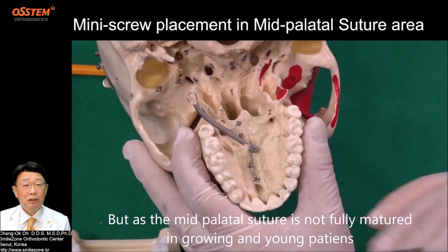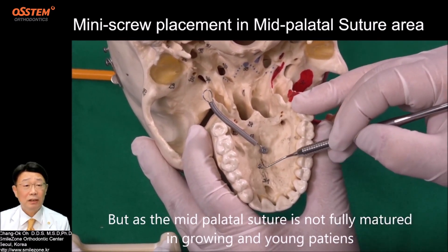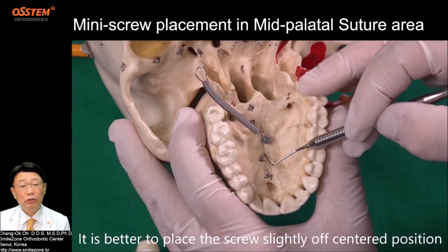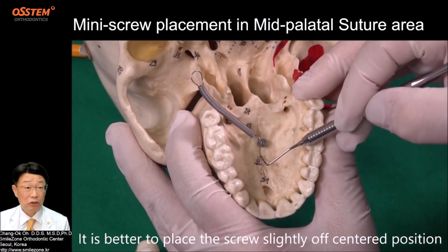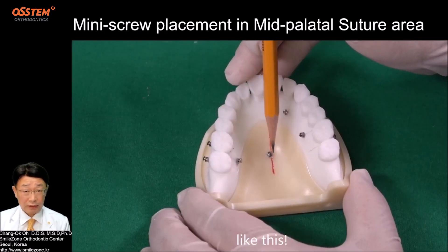But as the mid-palatal suture is not fully matured in growing and young patients, it is better to place the screw slightly off-centered rather than at the center or mid-palatal suture.